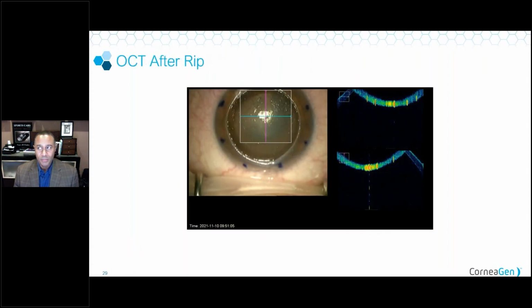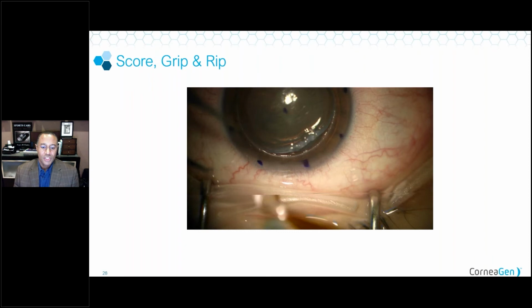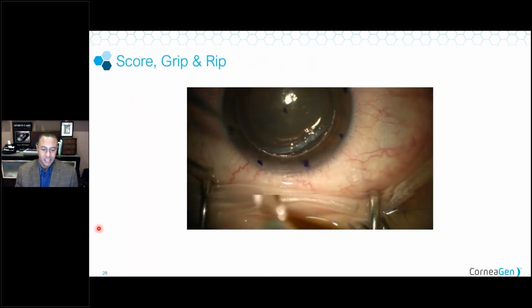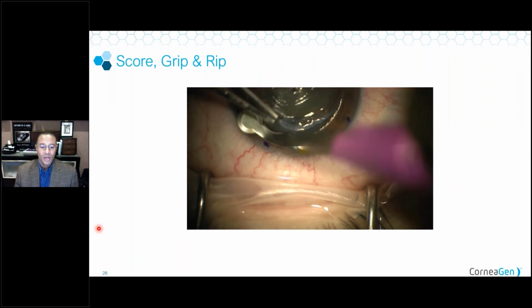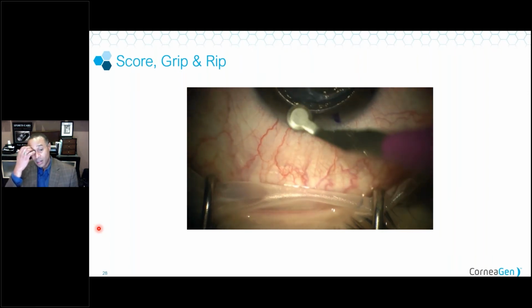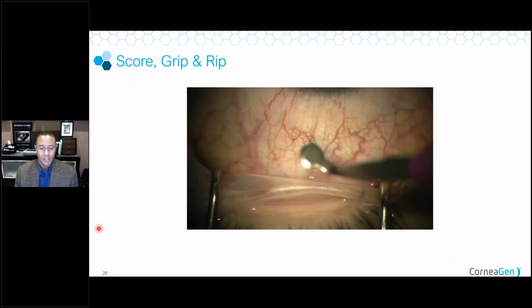As we go ahead and place the green forceps, the jaws of the green forceps can look very, very ominous. So you don't want to be afraid of these jaws. They're really not going to do any harm to the cornea. We're just trying to take a really good posterior bite of the tissue that we're trying to remove so that we have a good hold on it.